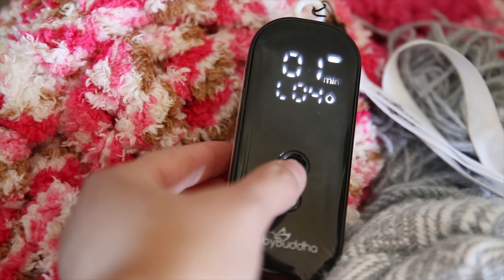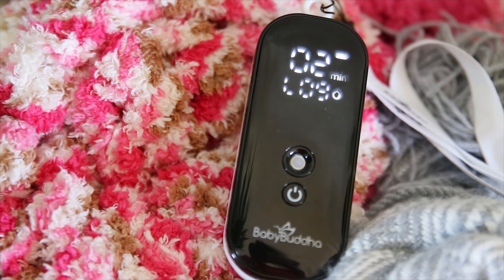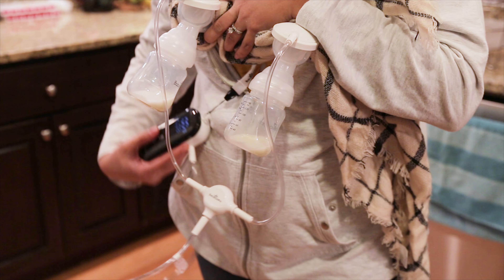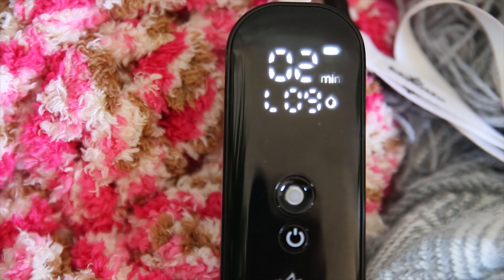Stay in level 1, or if you want, you can move up a level for higher strength. Switch back to the stimulation mode once a letdown is triggered and repeat. Making these changes also helps you have total control of the suction levels, because when it is first turned on, if you don't make a change, it will automatically go up in levels until it has reached the maximum massage mode.